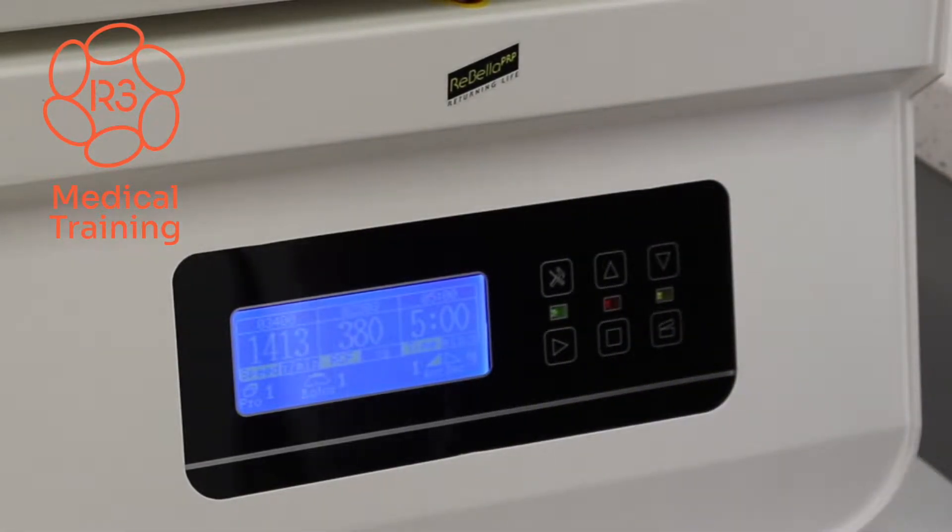You can hear the centrifuge activate. What I like to do is sit here until it gets to the appropriate RPMs, just to make sure we have it properly counterbalanced and there are no issues with the centrifuge possibly rocking back and forth like a wild washing machine, for lack of a better term.